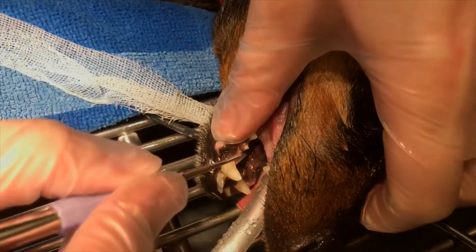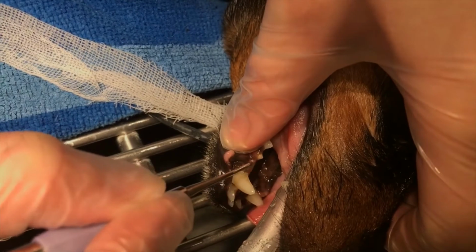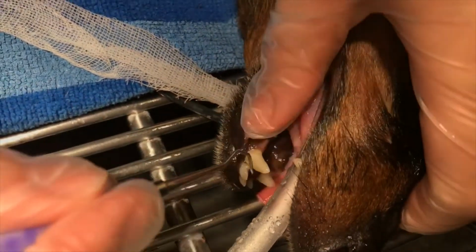But manually here on the canine as well. There again, I'm close to the gum line, but I'm being very careful to not snag it.